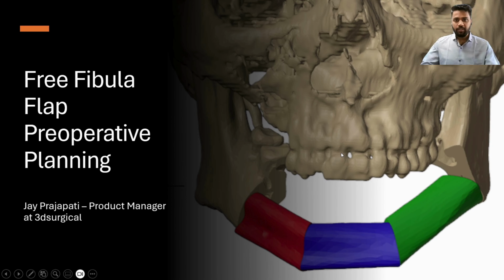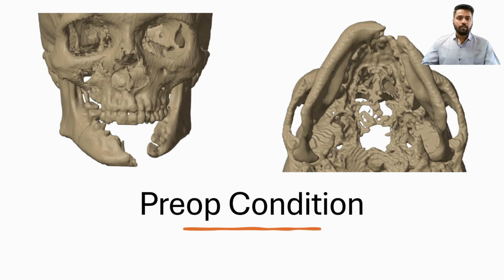Hello, I am Jay Prajapati, Product Manager at 3D Surgical, and today I would like to discuss the process for free fibula flap preoperative planning.